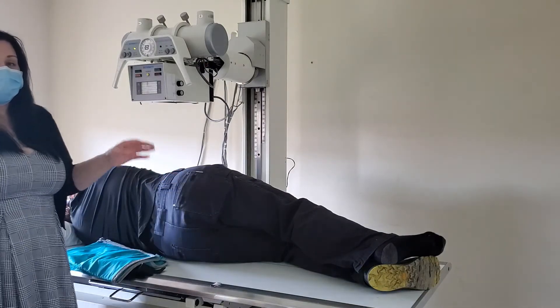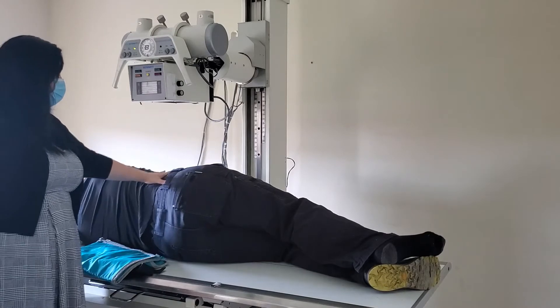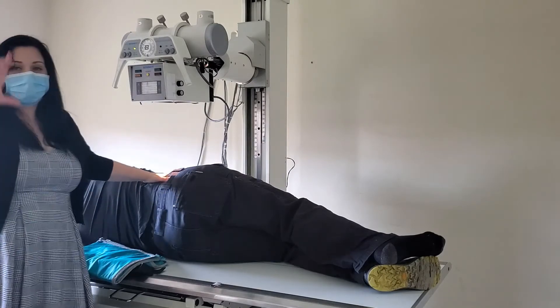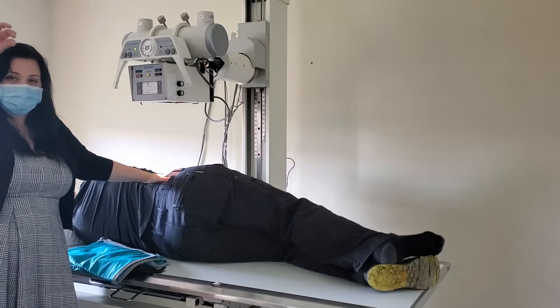Anytime I do a lateral lumbar spine, I follow up directly with my spot shot. I put my hand in that L shape and draw a line from the knuckle and the tip of the thumb — where those two points meet is where my central ray is directed.